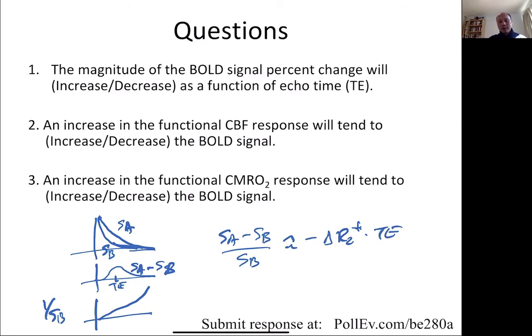Okay, let's do one more of these questions. Let's do question 2. So an increase in the functional CBF response will tend to either increase or decrease the BOLD signal. Okay, about 15 more seconds.